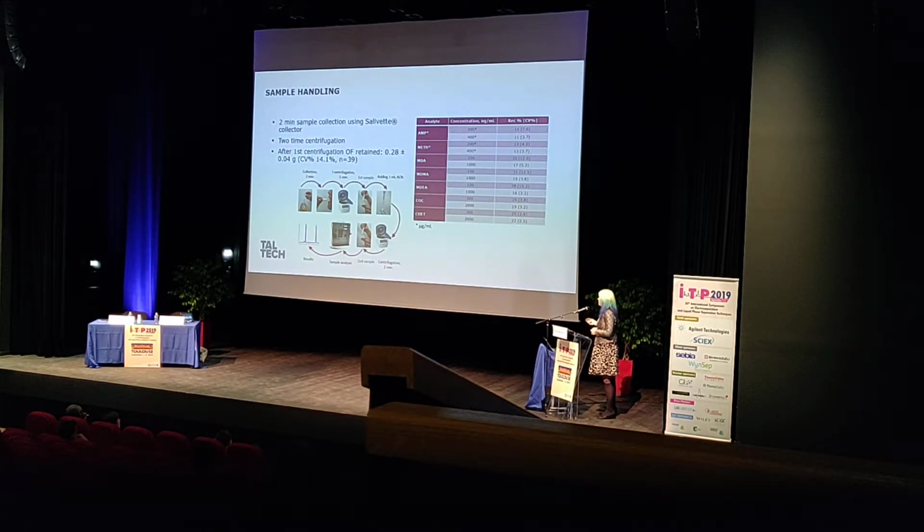After that we added additional acetonitrile, centrifuged the sample again, and the second centrifugate was then used for the analysis. We also evaluated recoveries at 2 concentrations for each of the drugs of abuse. The recoveries ranged from 11 to 35%, which is not a lot, but as we'll show you later, it wasn't an issue.